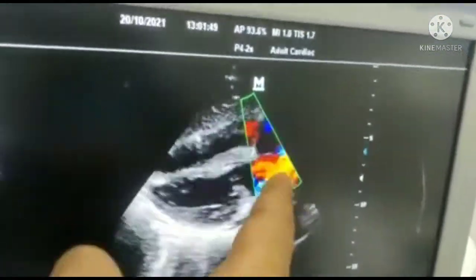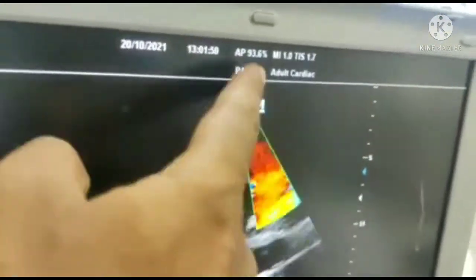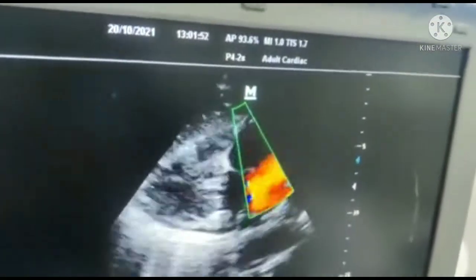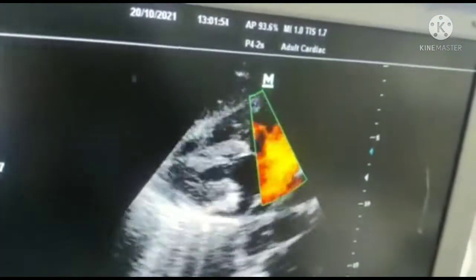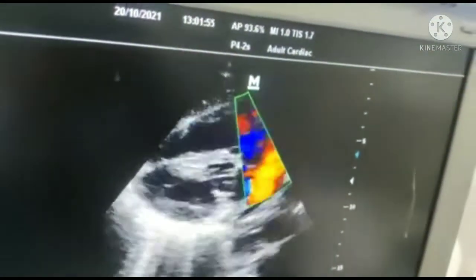Predominantly the flow is towards the right atrium, which confirms the left-to-right shunt. Let's assess the shunt further.